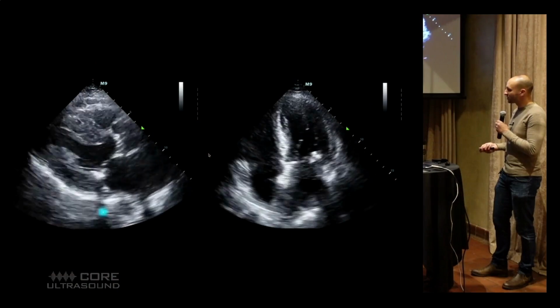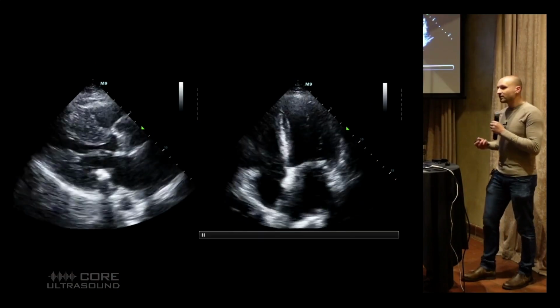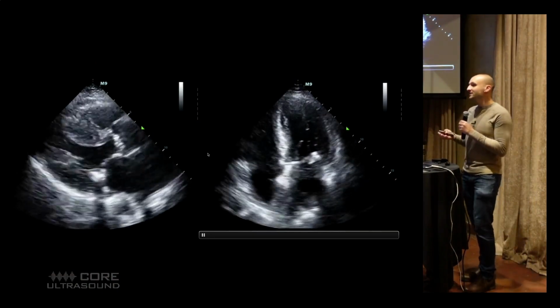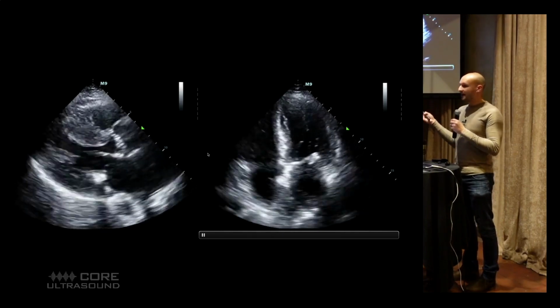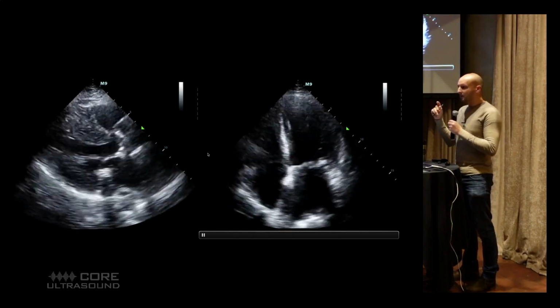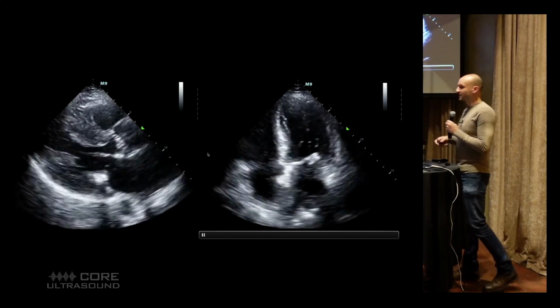The one kind of grading thing that I do like to talk about is just with severe aortic stenosis. I have a lot of elderly patients that come in with pre-syncope or syncope, right? And when I see this, and I see this pretty commonly, a little bit of calcification on the valve, there's calcification with some shadowing. I see this fairly frequently, and my question is, is this stenosis, which I feel like all people past the age of 80 have a little bit of stenosis probably, you know, is this stenosis the reason why they syncopized, right?